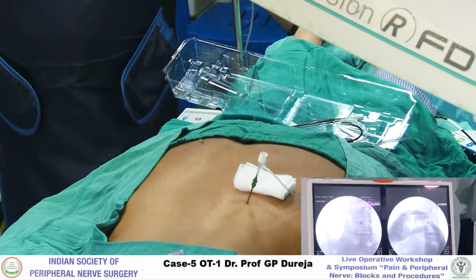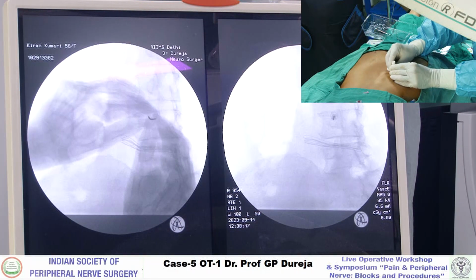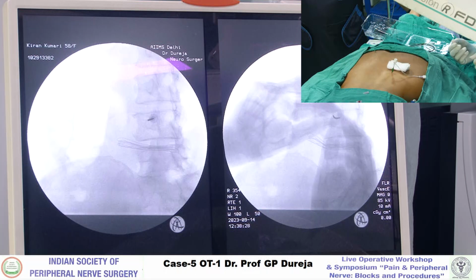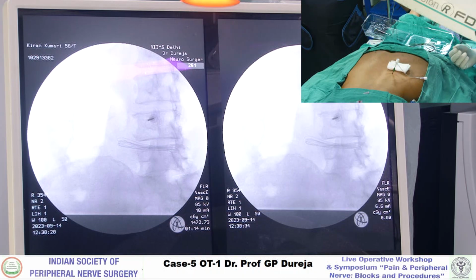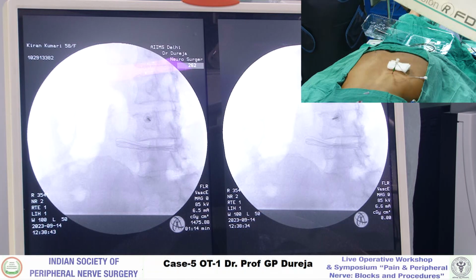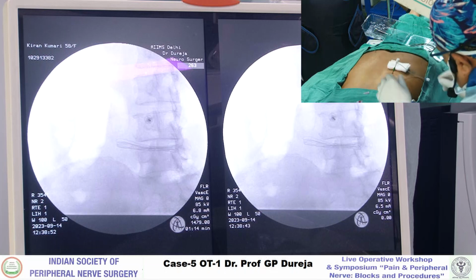Yes sir, we can see. चलो. अरे क्यों कर रहा है यार? तो देख नहीं रहा तुझे? दिखाओ. हाँ ठीक है. बोल आगे. दिखा. दिखा. चलो. एक मिनट चेक कर.